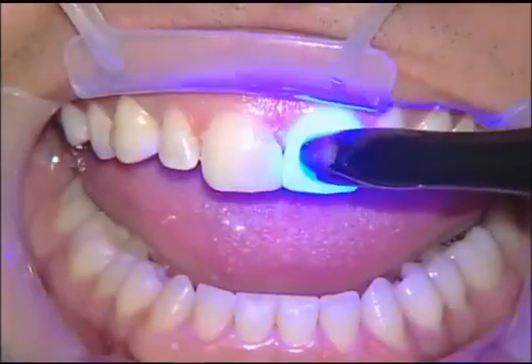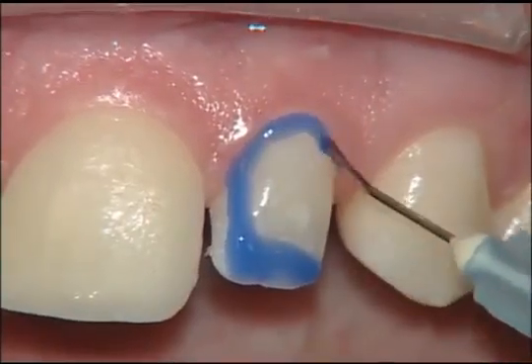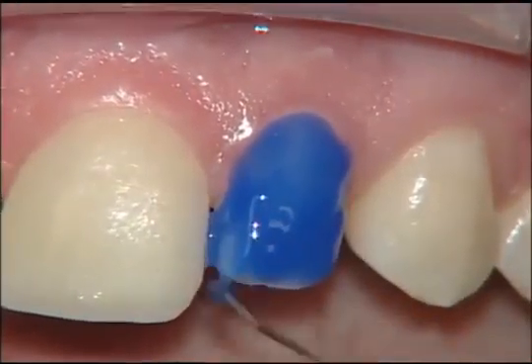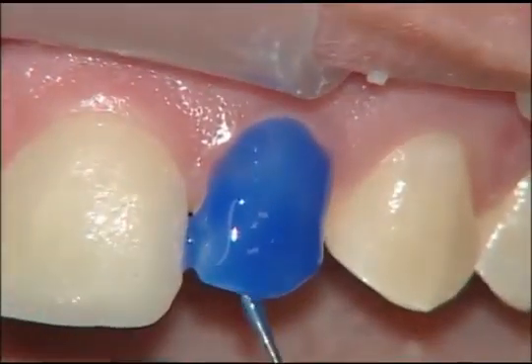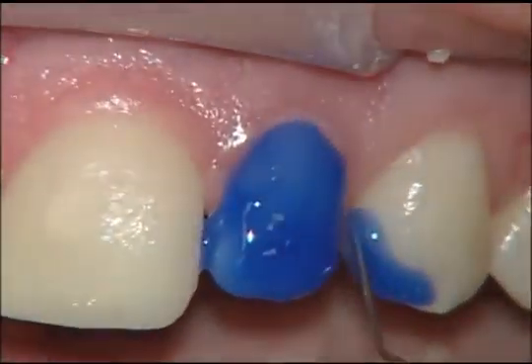Again, the reason we do the 2 central incisors first is because they're very critical to the outcome of the case. And when you're trying to seat a bunch of veneers together, if you do have contact issues, it makes it difficult to deal with because everything's kind of a moving target. So when I do these types of cases, we'll put the central incisors on first, and then we'll go ahead and place the rest of the veneers. And if we have contact problems, then we'll just kind of make it up as we work our way back.